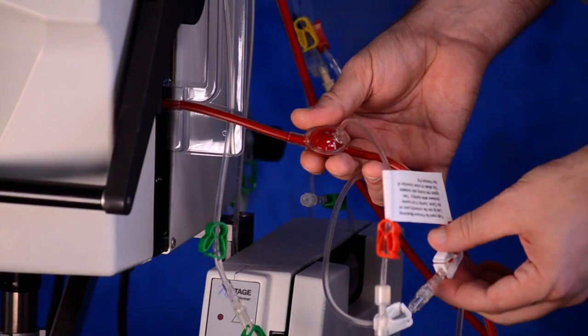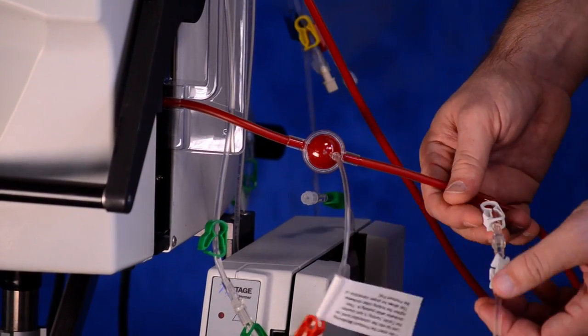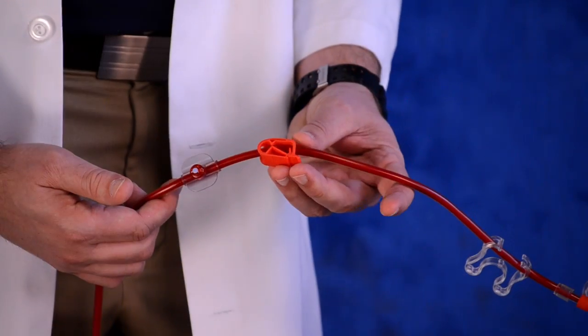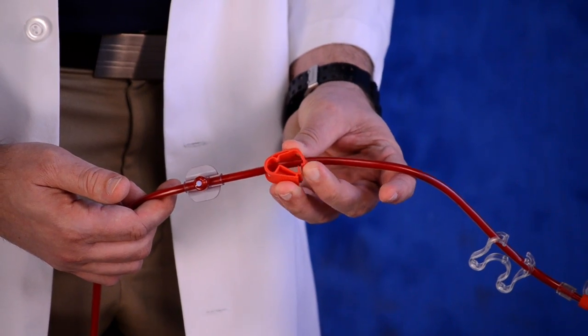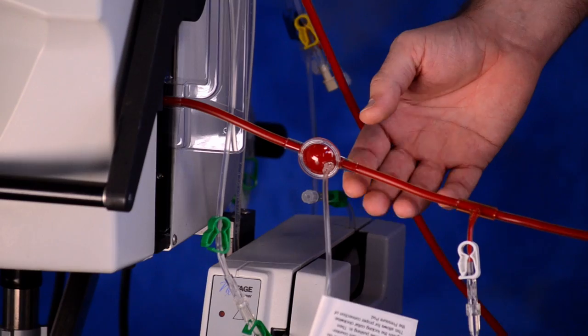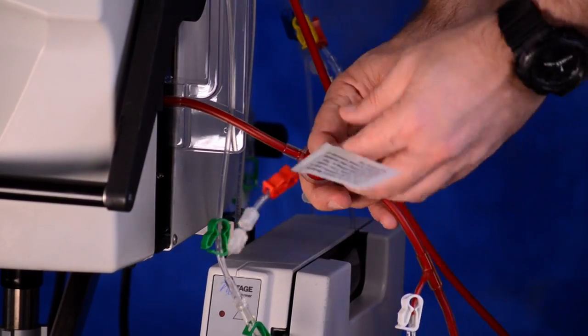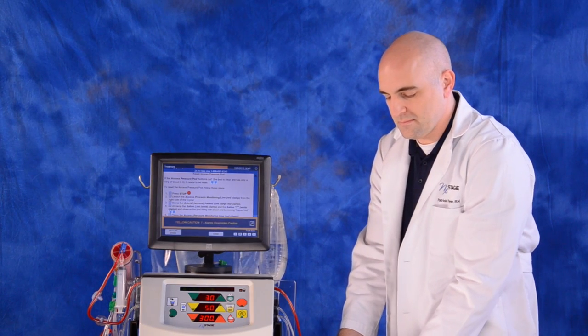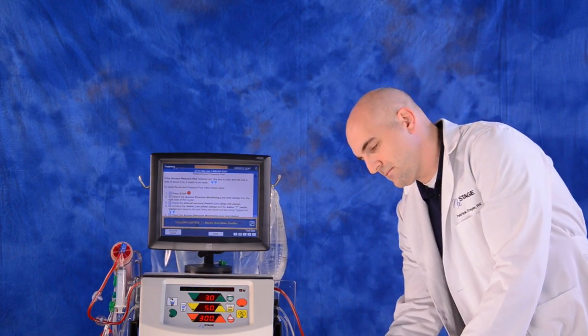Clamp the pressure pod monitoring line. Clamp the saline line white clamp and the saline T clamp. Unclamp the patient's arterial access line red clamp. Press the green treatment key on the cycler interface.